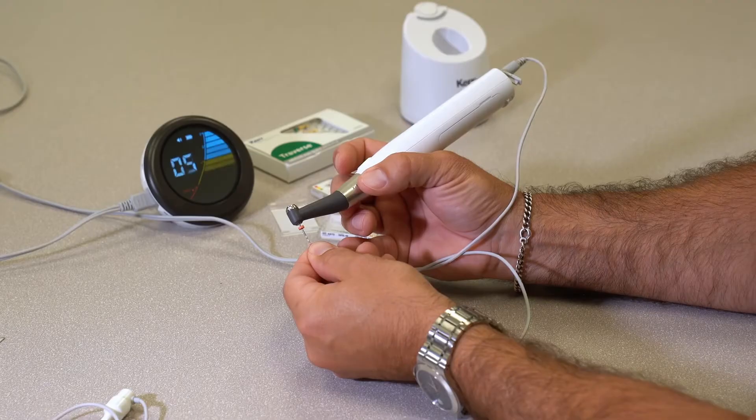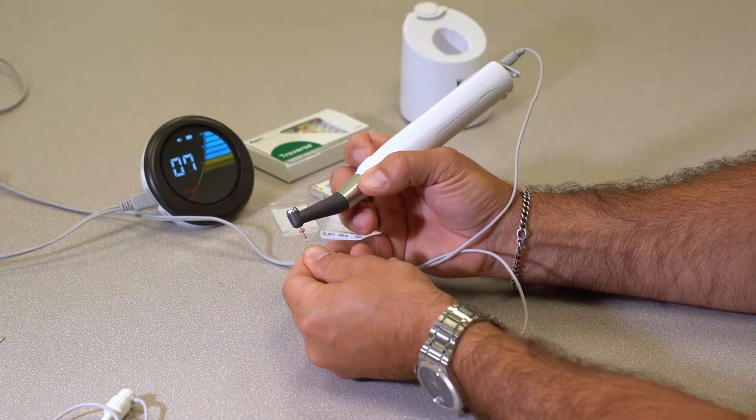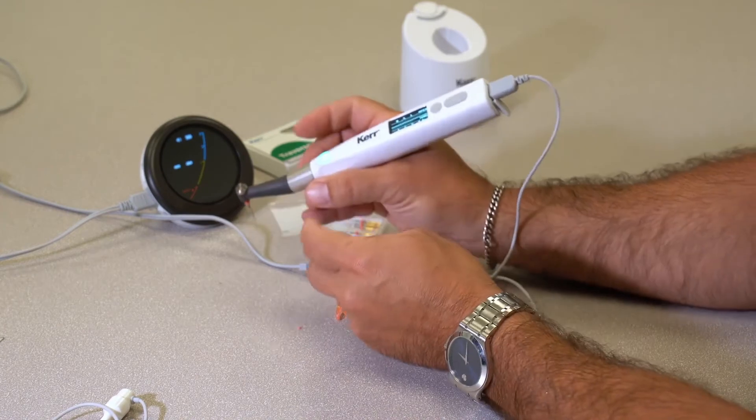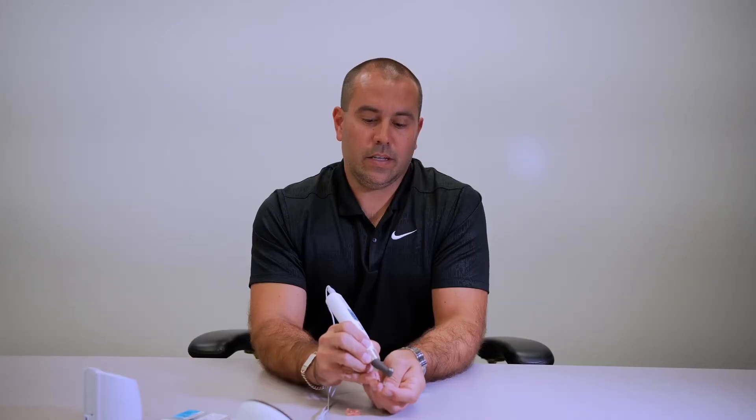Blue means I'm still a ways away, yellow means I'm getting close, red means I am there — I am out the Apex. You can see both the button here as well as the Apex locator telling me that I'm out.